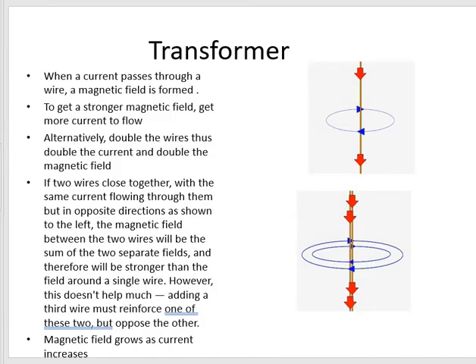This is the basis of the working principle of a transformer. A voltage transformer can be thought of as an electrical component rather than an electronic component. A transformer is basically a static electromagnetic electrical device that works on the principle of Faraday's law, as explained earlier.